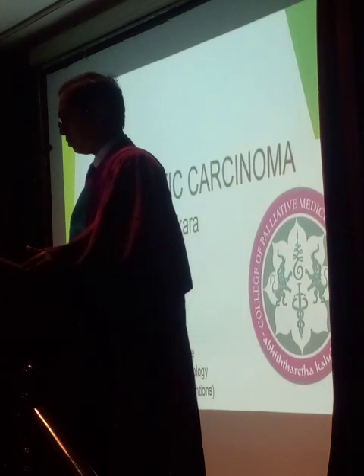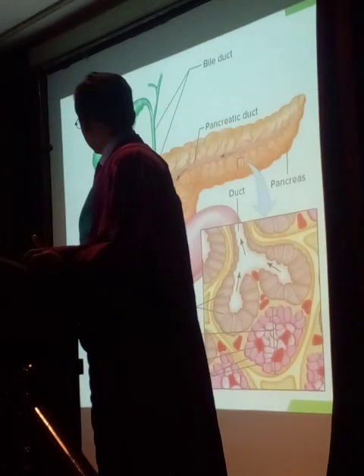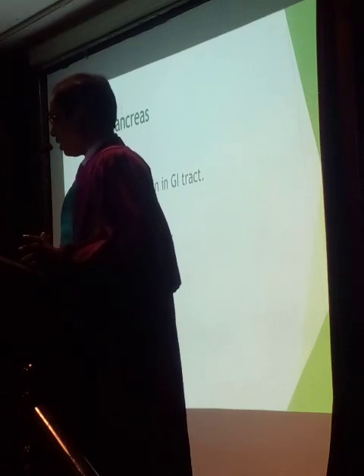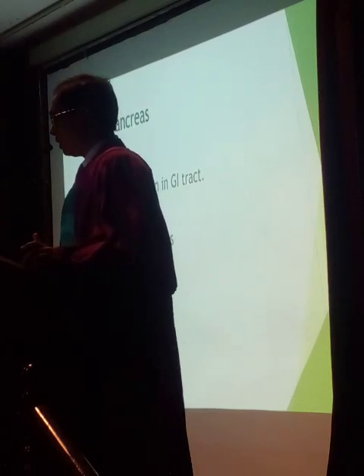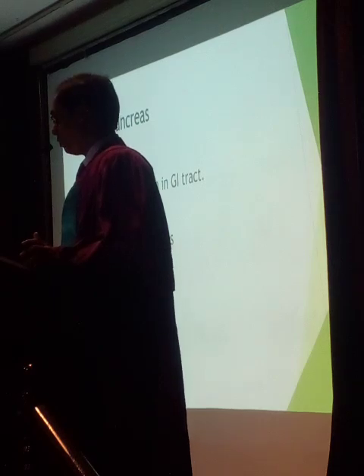So when we think about the modalities that we can use, first we need to have an idea about what the pancreas is and its anatomy. All the things were covered by Ranga, so it's easy for me, but without knowing the anatomy, we can't predict in CT or even at ultrasound.